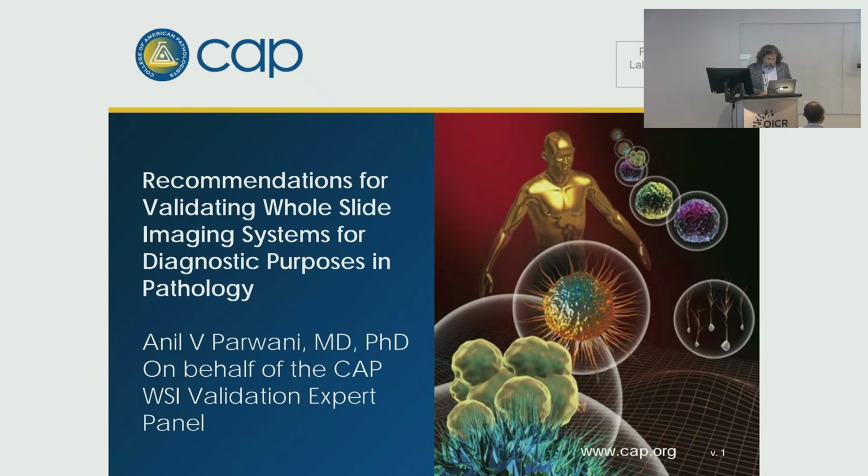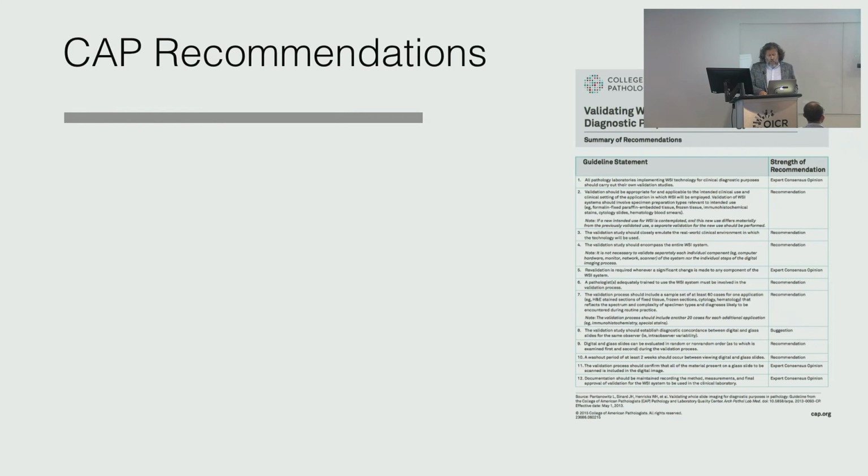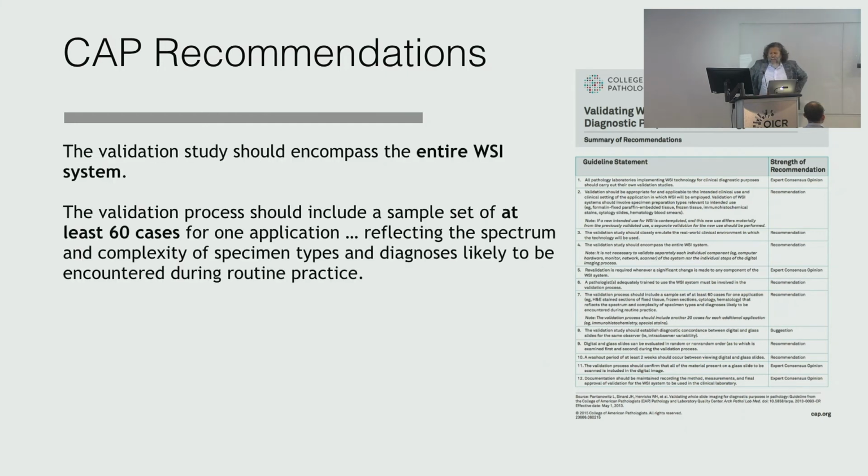The College of American Pathologists has published one of these documents, which you can download at cap.org. Dr. Parwani is one of the pioneers of digital pathology in the US. They make some recommendations, and I grabbed three or four of them. The first is that you have to evaluate the entire WSI system, because you're replacing the microscope with a scanner, a computer, and a display. All those three components together are the replacement for the microscope, so you have to evaluate them together.